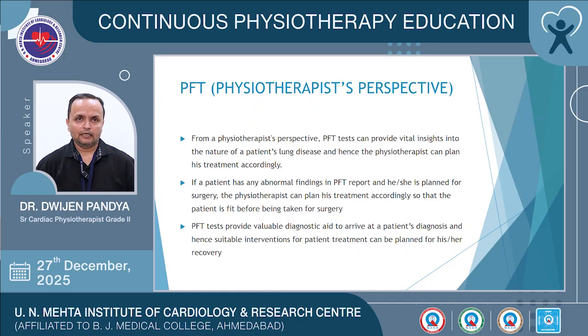Coming to the last part of the lecture, that is the physiotherapist's perspective. From a physiotherapist's perspective, PFT tests can provide vital insights into the nature of a patient's lung disease and hence the physiotherapist can plan his or her treatment accordingly. If a patient has any abnormal findings in the PFT report and he or she is planned for surgery, the physiotherapist can plan his or her treatment accordingly.